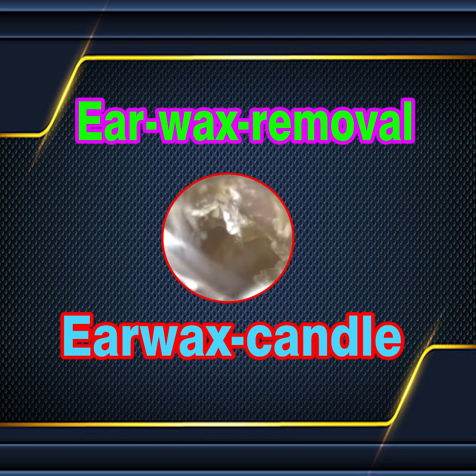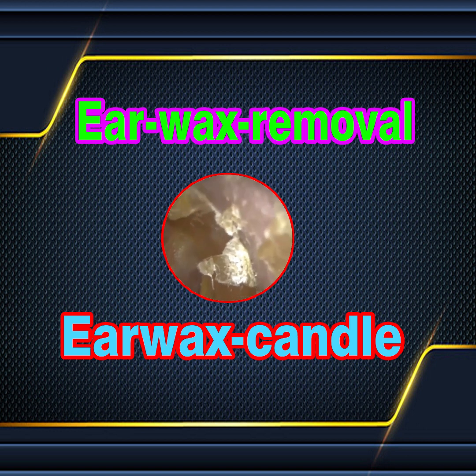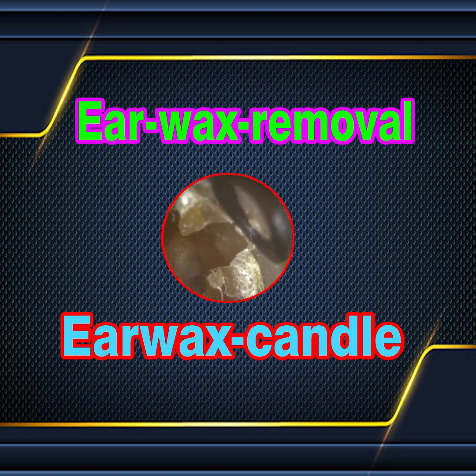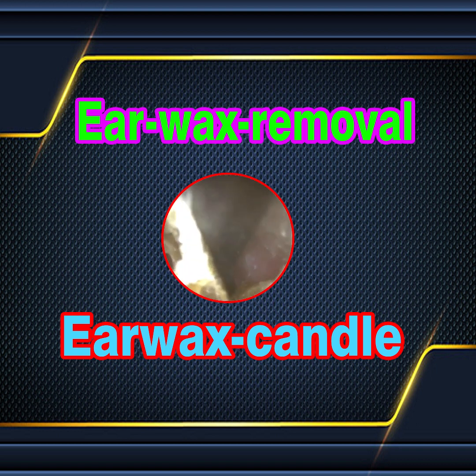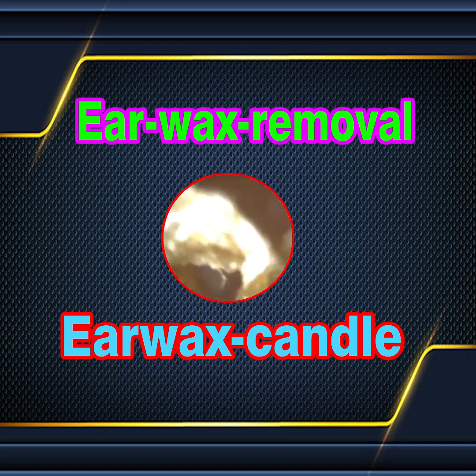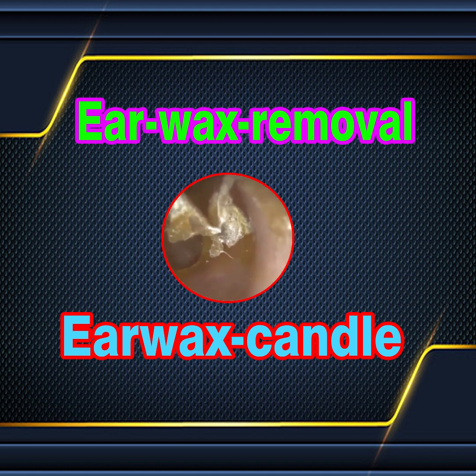So now I've removed most of the discharge off the eardrum, and we are going to get some out afterwards, but here I'm now going to use the Curette to help elevate and retract this crusted layer of skin off the ear canal. So this skin has been coated by some of the discharge in the ear, and that discharge is then solidified and it's crystallized the skin, and you can see that we've lifted the entire blanket and thick layer of skin that was sitting on the anterior canal, or the front part.